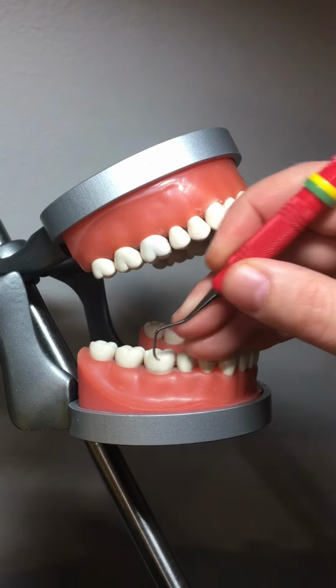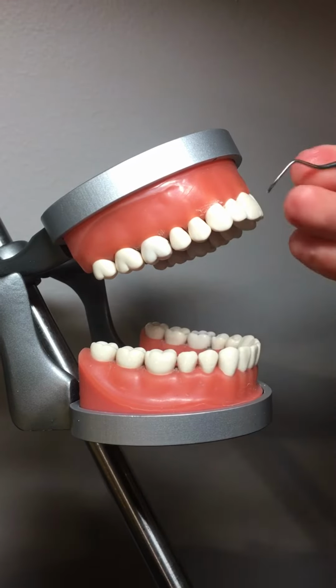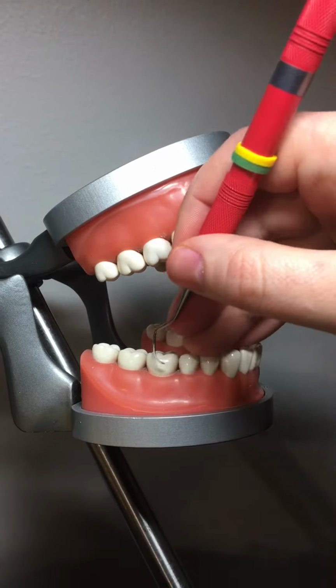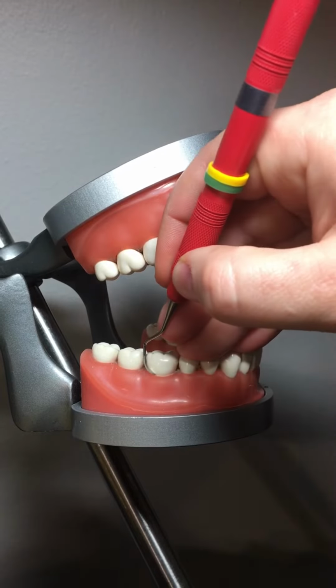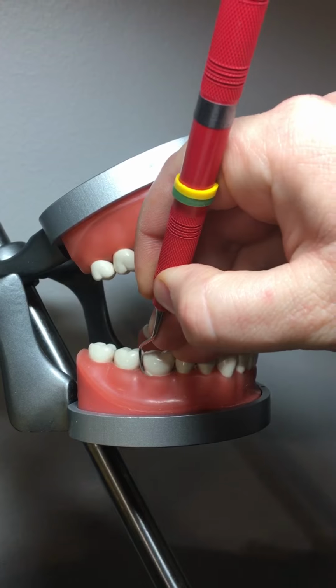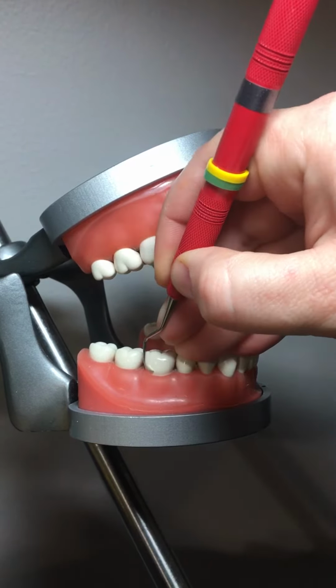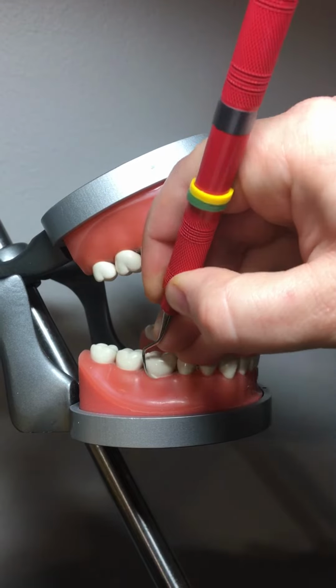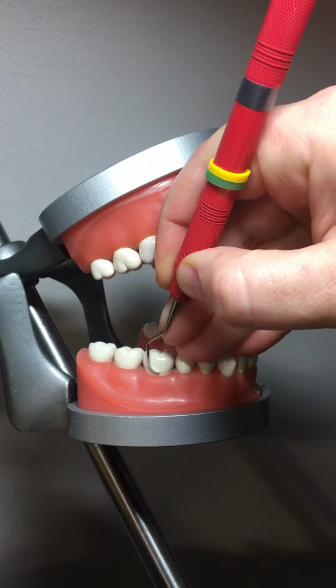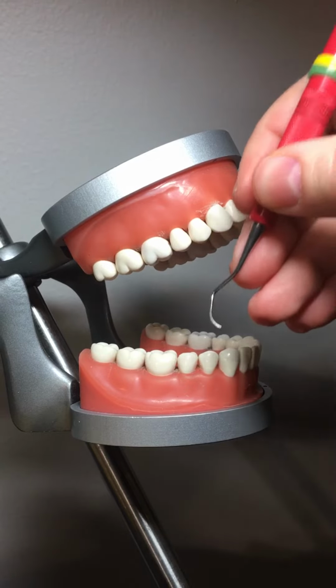Hello everyone, I'm going to review the three common calculus removal strokes. The first being the vertical stroke. So the vertical stroke is as you are up underneath the piece of calculus, you're moving your instrument from apical to coronal, up and down, like so. And you want these strokes to be short, controlled strokes.